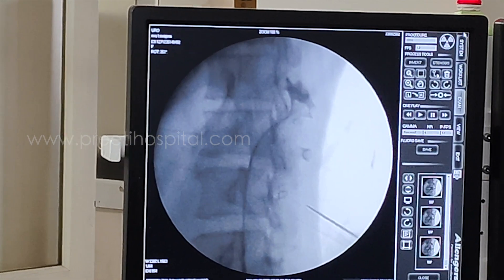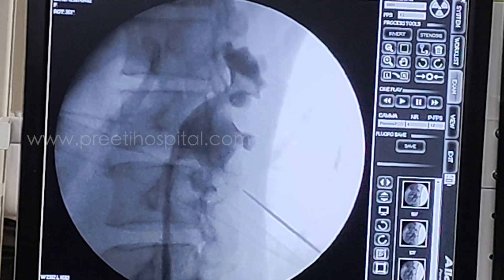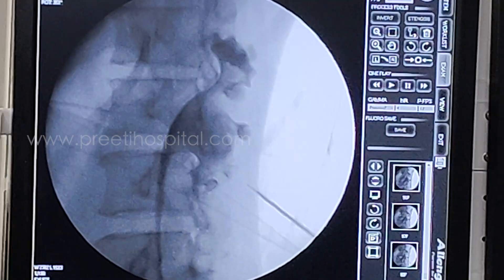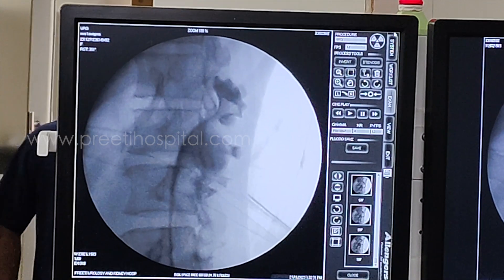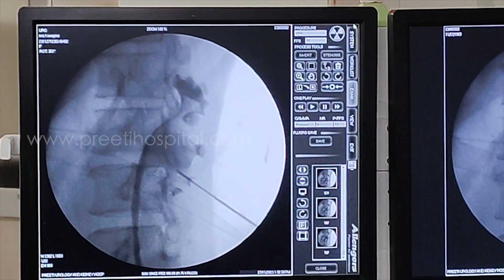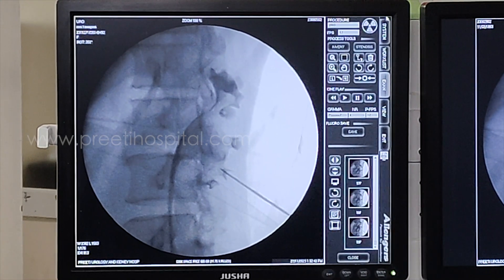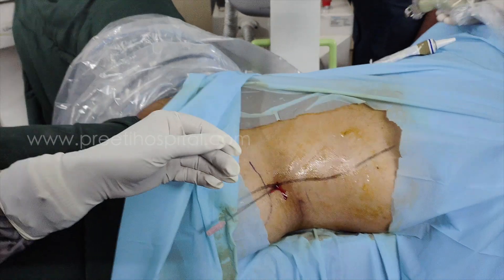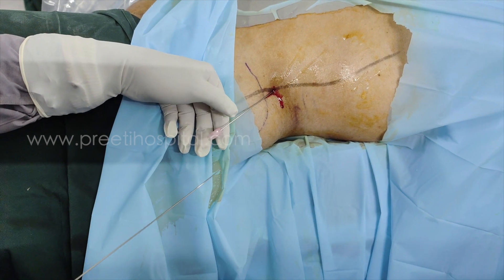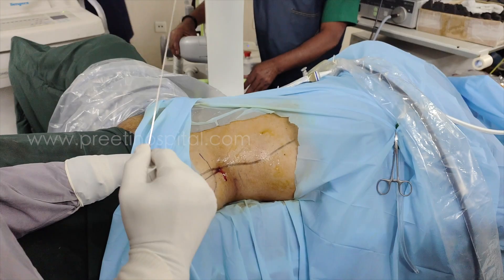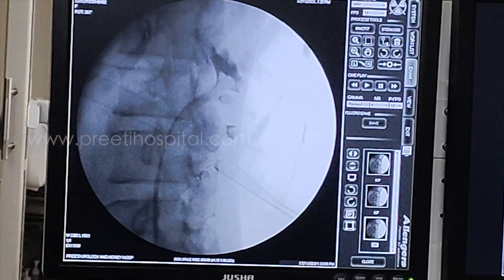Now I am able to inject contrast. My aim is this calyx. You can identify a little bit down as well. If you turn down and see how it is moving — if you turn up, it is moving. That means it is an anterior calyx. In this calyx I want to lift the stone. I will move and withdraw. Ideally the water should come here. The needle has gone down — down means posterior. So I am telling it is anterior. Wait there and now slowly, without moving the needle, go anterior and angulate properly.